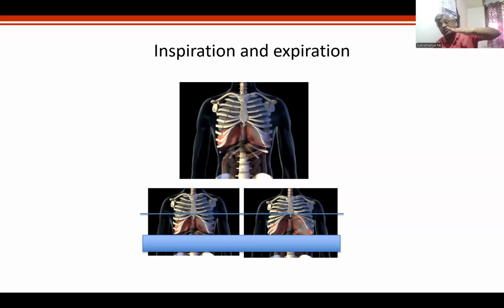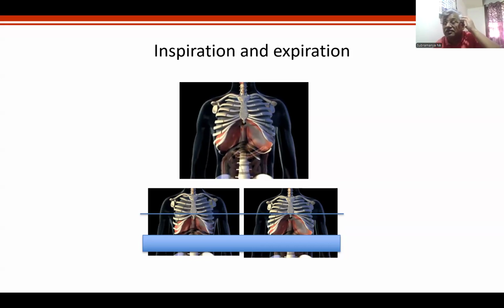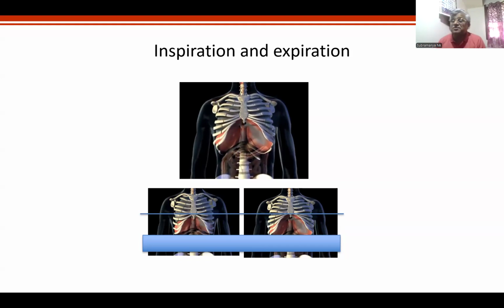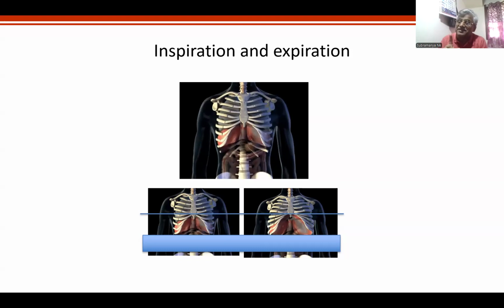It's also about your cutoff. One half of your mind's interpretation goes to the upper half of the chest X-ray, while the pathology is really in the lower half. Dr. Charul, do you agree with me? We spend more time seeing the upper half of the chest X-ray than the lower half. I would put it the other way around. Do you agree? Please type EAG, all of you, if you agree.